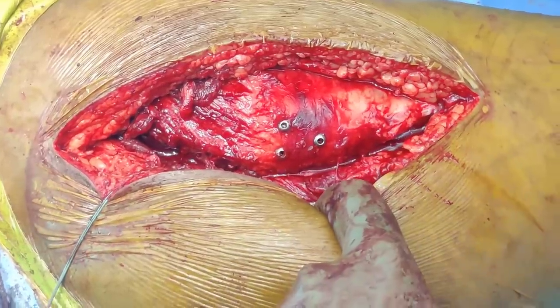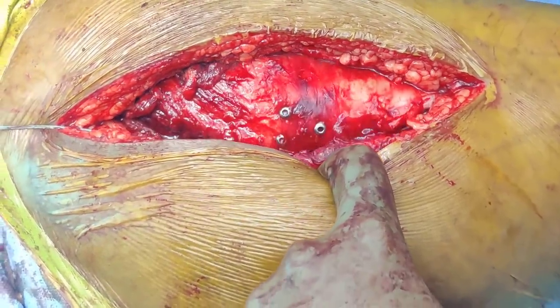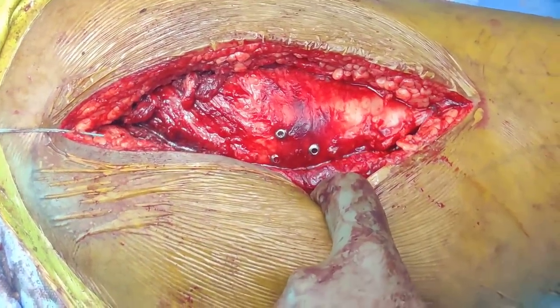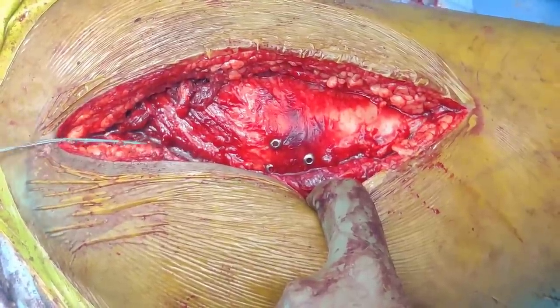The GT is now fixed and you can see it is quite stable — even if you want to move it, it remains stable. This is internal rotation and this is external rotation. After this it is just routine closure, which I am not going to show you. This is how you do a safe surgical dislocation of hip.